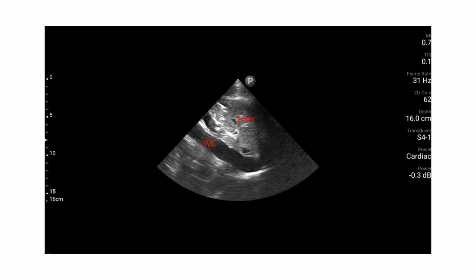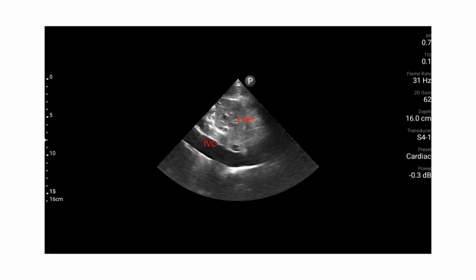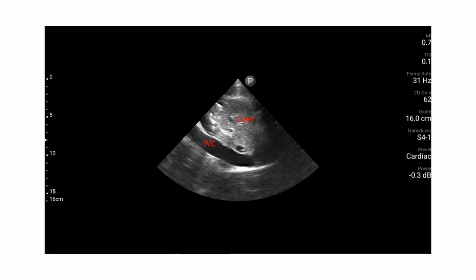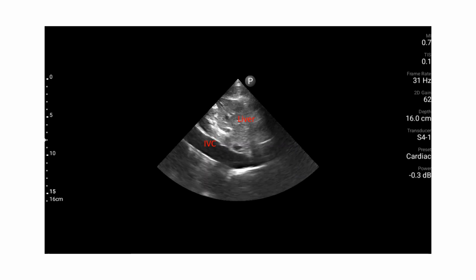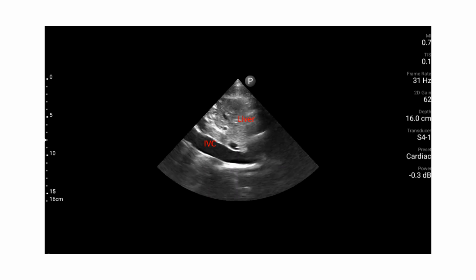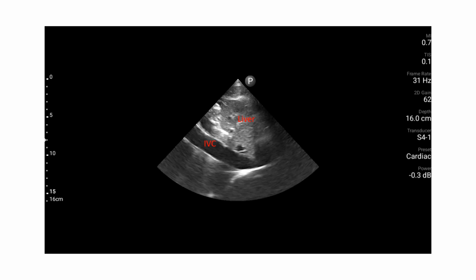And so if you use that in tandem with the cardiac assessment, that can tell us some things. So if I did my cardiac assessment and I saw a poor ventricular contraction, and then I saw an IVC that was not collapsing, and a patient who is hypotensive, that's much more pushing us towards some sort of cardiogenic type shock state, and that maybe inotropic therapy is indicated, versus if I saw a hyperdynamic heart with a spontaneously collapsing IVC, that would tell me even more so that I might be dealing with hypovolemic or vasodilatory shock.